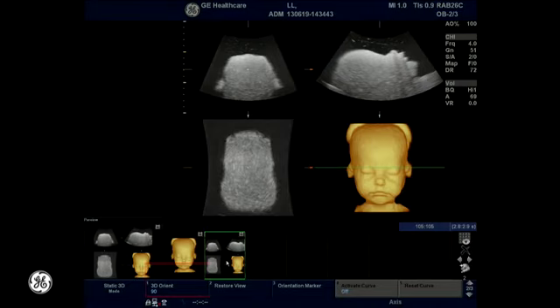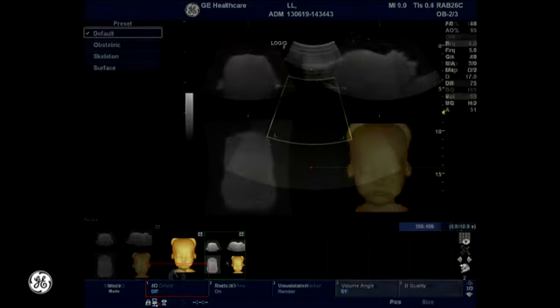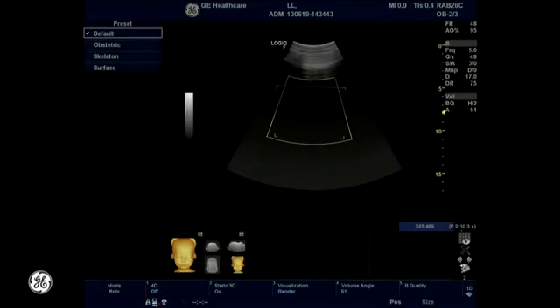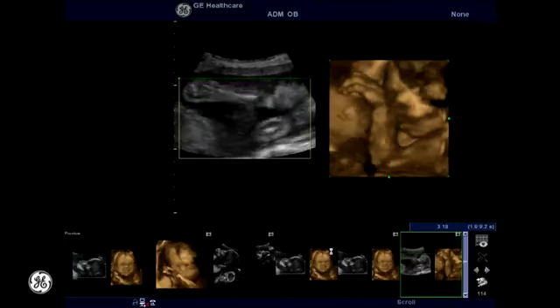The main difference between static 3D and 4D options is the dataset acquisition. We just demonstrated the static 3D option that automatically stops the data sampling. The 4D option allows you to decide when the sampling is complete.